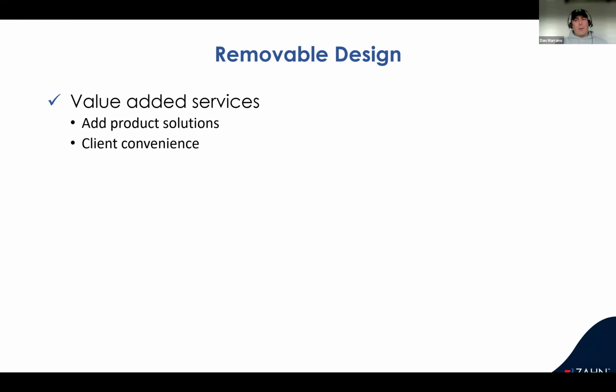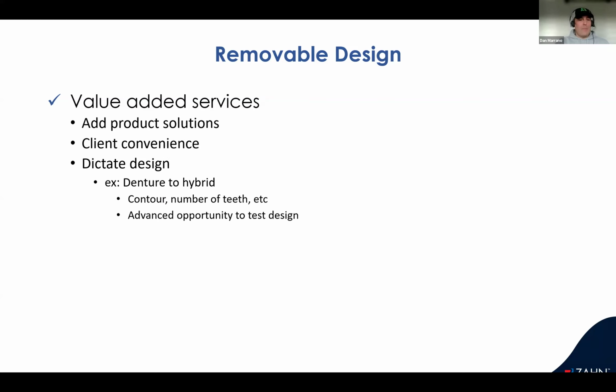Definitely convenience. The flippers started more because I hadn't done a digital flipper, and it was about a year ago. Somebody said, "Well, patient's having heart surgery. Can you get this back with the crown so he can have his flipper before he goes to have his heart surgery?" And so we were able to accommodate them for that.